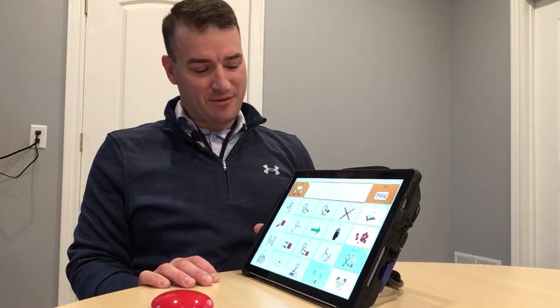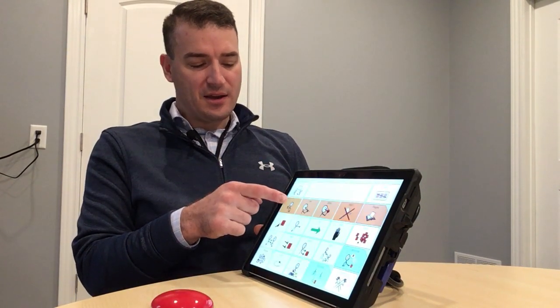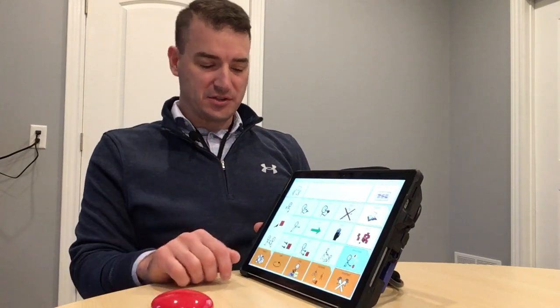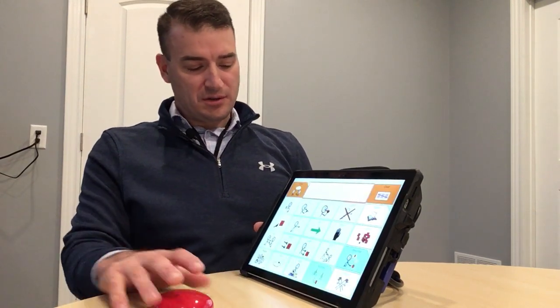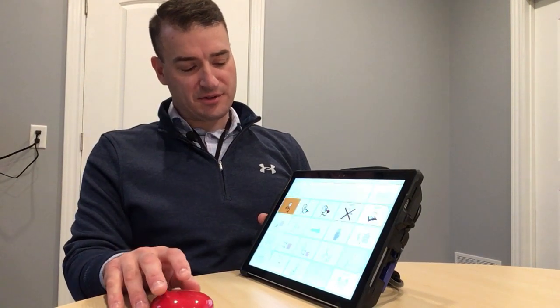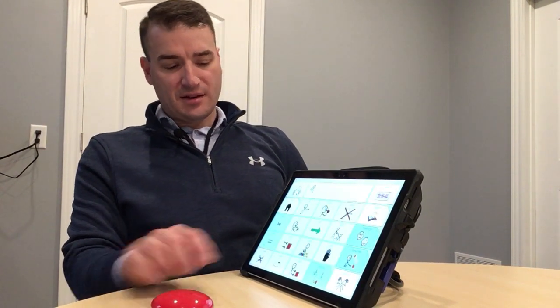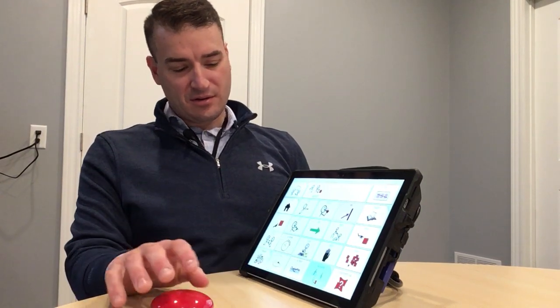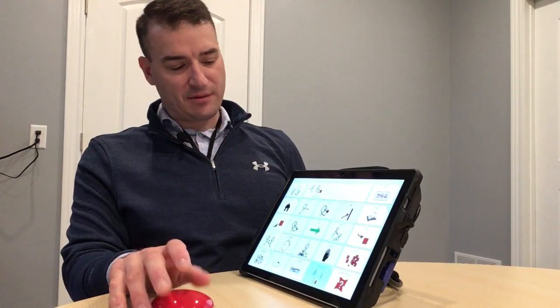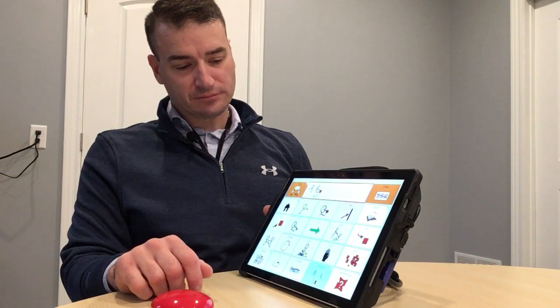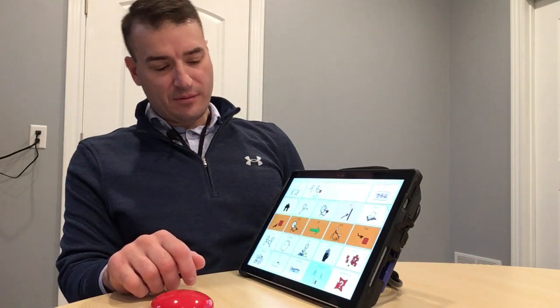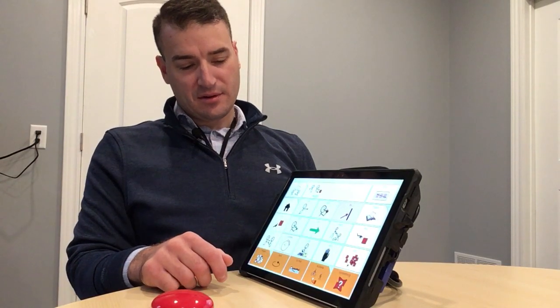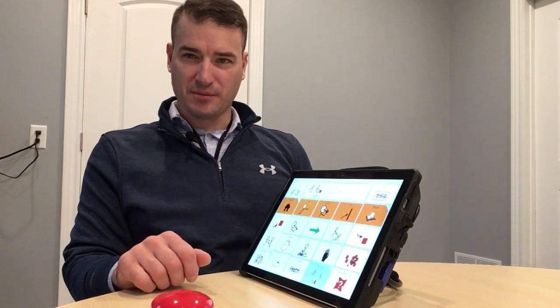My users are very proficient at scanning. So if I wanted to say 'I,' what I would do is wait for the software to highlight the I and then hit my switch — the row that has I in it. And now my next selection is 'want,' so I'll come down here, press the button again, and when the column that says 'want' is highlighted, then I would hit my switch, and then press it again.